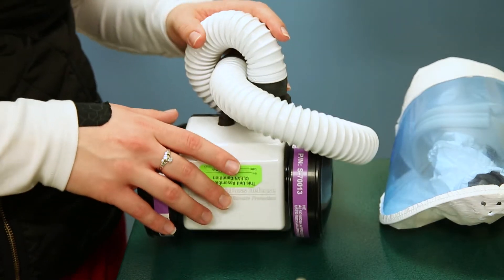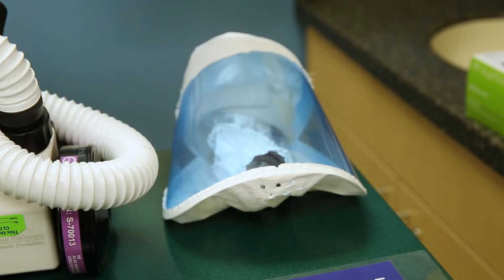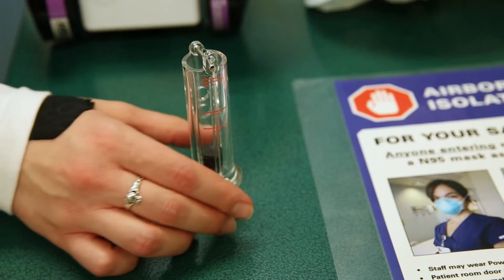Your PAPR system has four main parts: the blower, the hose, the hood, and the airflow indicator.